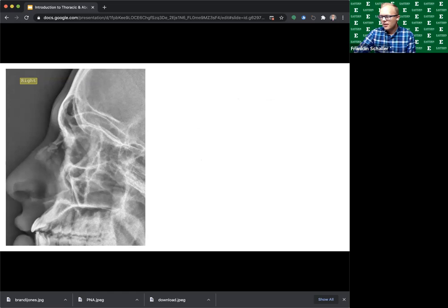All right. So this scenario is a 26-year-old female. She was hit in the face with a baseball just prior to arrival and initially had some epistaxis, but that has now resolved and is coming into you today complaining of nose pain. On exam, the nose is tender. There's no obvious deviation. The nares do have some dried blood upon inspection, but luckily the nares are patent bilaterally. And you order a nasal bones x-ray.